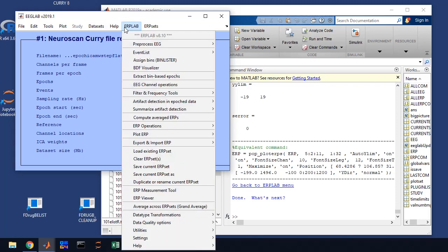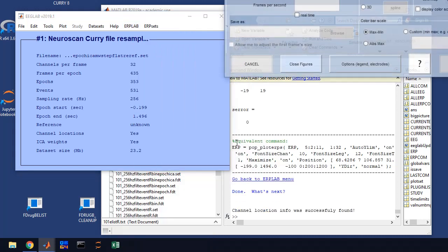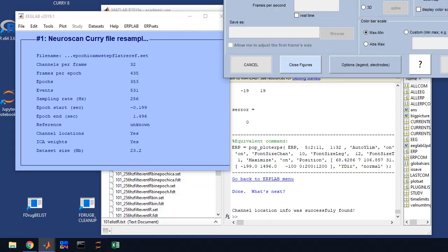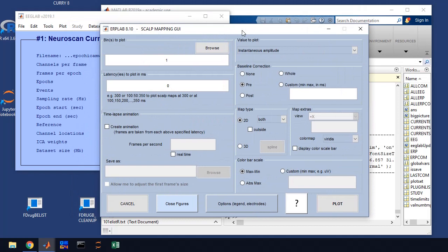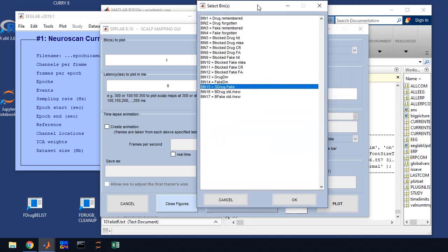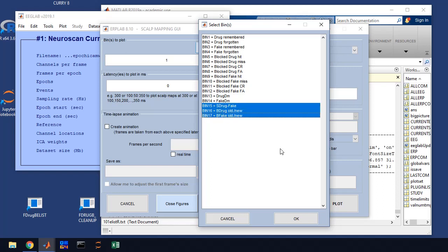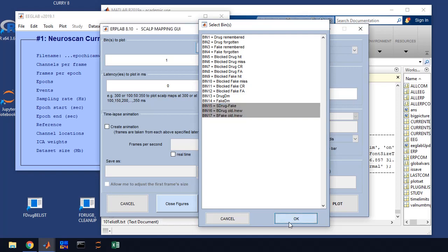Next thing we want to do is we're going to plot the scalp maps. So you're going to go to plot ERP scalp maps. And this window will come up. The first thing we're going to do is set the bins, so we're going to do the study phase, study drugs minus fake drugs, and then test phase, drug old new effects, and fake test old new effects. And so we're going to select those bins. Again, this is specified in your protocol.